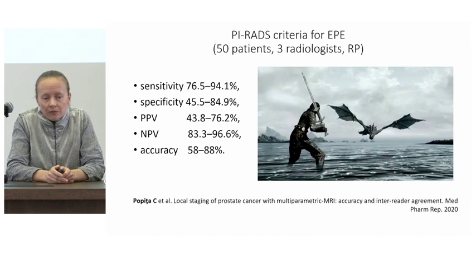How does it look in clinical studies and papers? So here is Cluj-Napoca from Romania. It's a big center in Eastern Europe. And despite PI-RADS being old school, I expected clear results from it. Results are not so clear, it's not black and white, it's rather like 50 shades of gray. And you may see differences in sensitivity and specificity. It's due to disagreement among readers. But take a look at the negative predictive value, it's quite good.